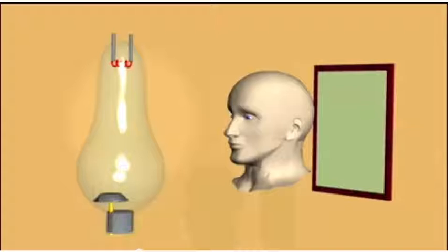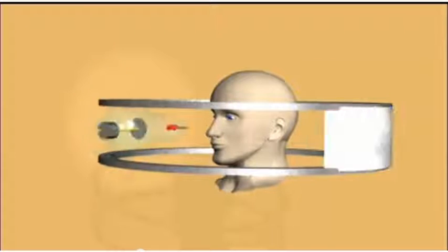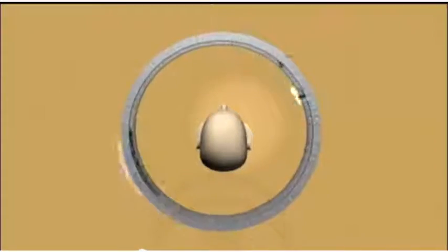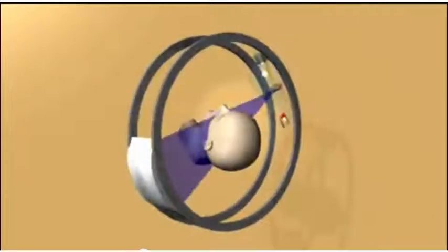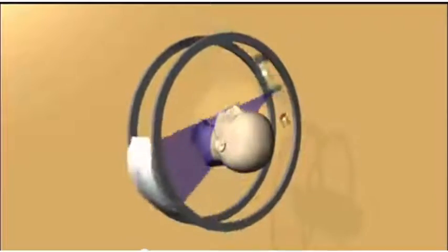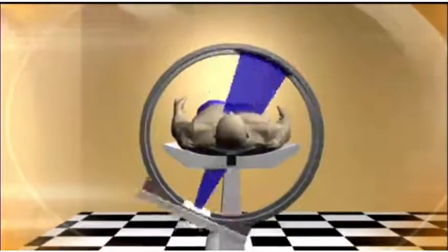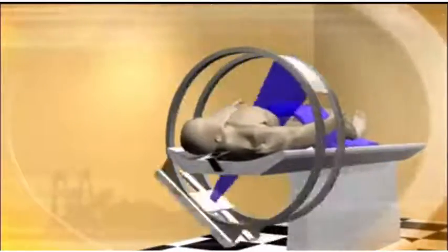There are different generations of tomographs. The first generations of tomographs consisted of 1 to 2 detectors. Now, the modern tomographs, 4th through 6th generation, consist of nearly 5,000 detectors located in a concentric ring. And they normally use the helicoidal scanning technique in order to shorten the scan. Modern CT uses a helicoidal movement.